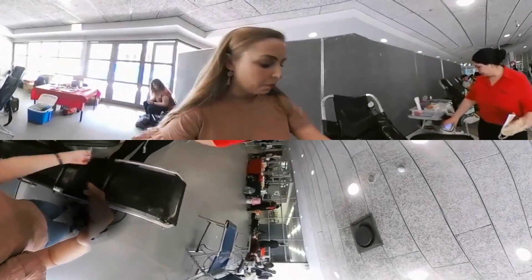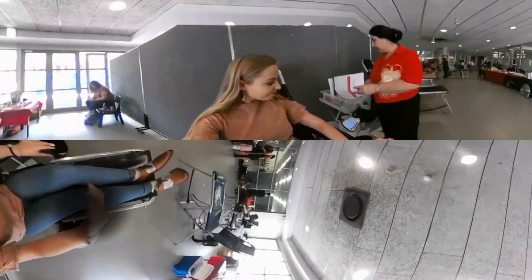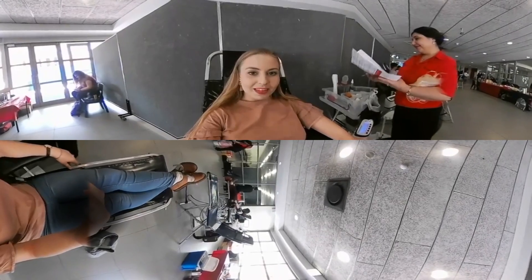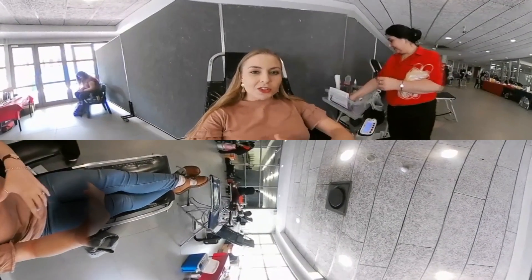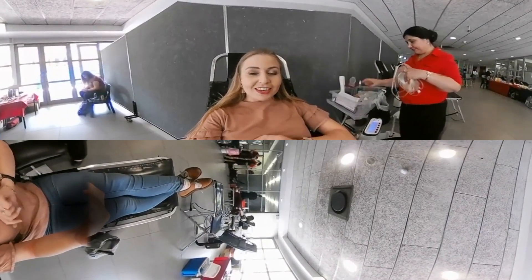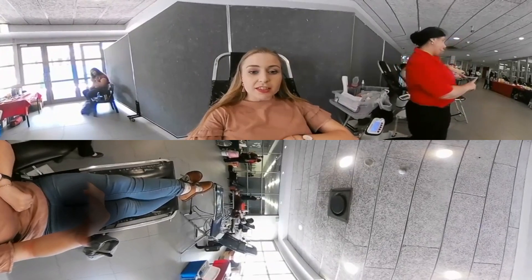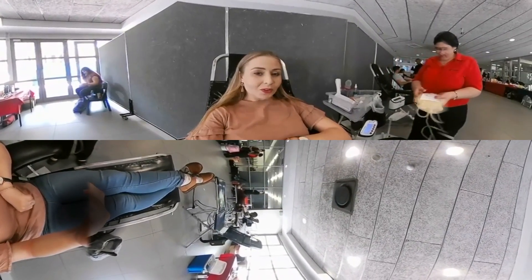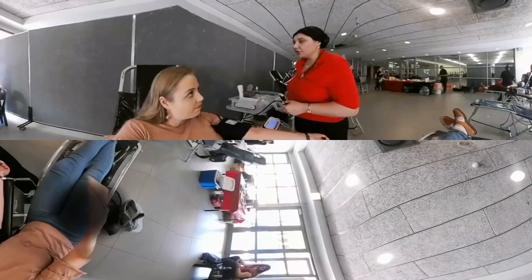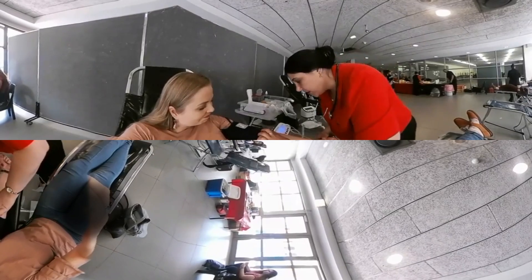My left arm is usually where my vein is the strongest. Normally I'm quite nervous about needles — they're not my favorite things — but if you close your eyes and look away it's not as bad. Some people handle it really well. I do struggle, I have trust issues, so it is quite a thing for me to do this. The nurse asks me to put pressure on my veins and make a fist. She says she can see a very beautiful vein.